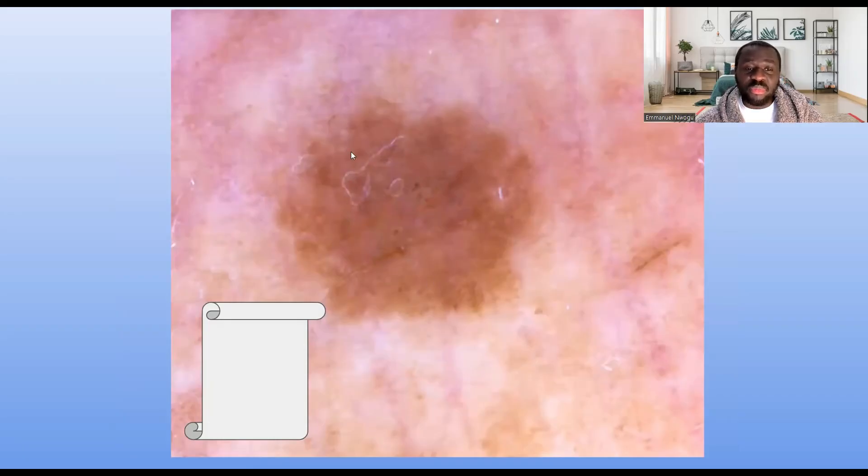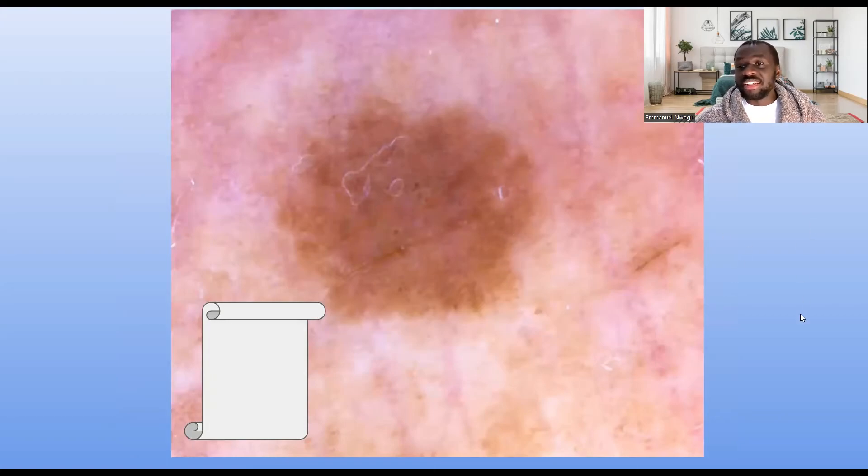This lesion looks completely benign — regular margin, symmetrical. If I divide it into two horizontally, it gives me two equal halves. The level of pigmentation is uniform, homogeneous. It's not clearly reticular, but there's a little bit of reticulation — a reticular network on the periphery. This is clearly a benign melanocytic nevus.